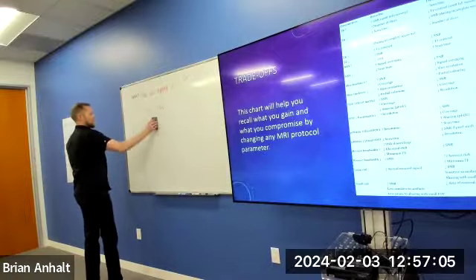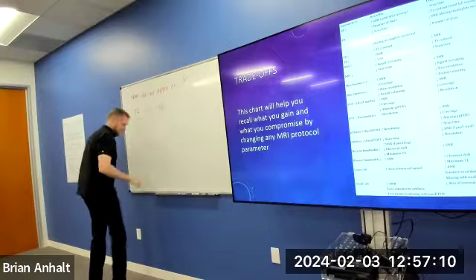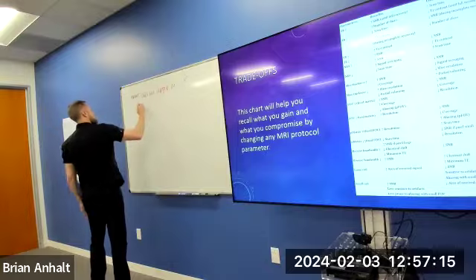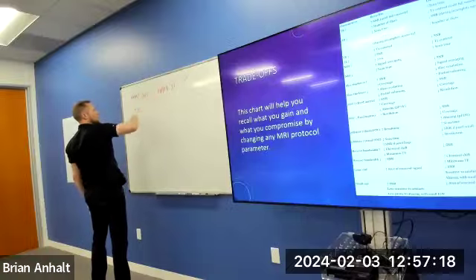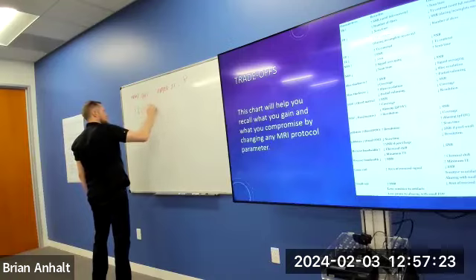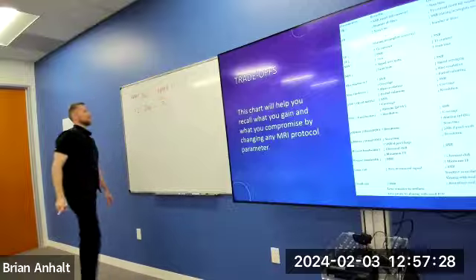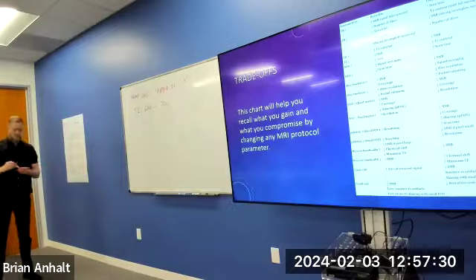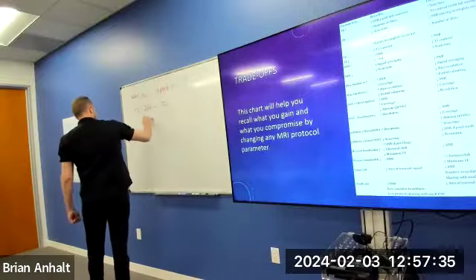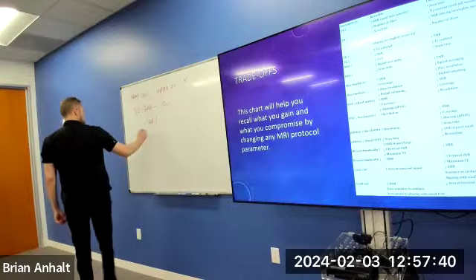What does not happen if TR changes? I want to say what does happen. Is the whole list. What happens if we take our 3000 TR and move it down to 700? SNR does what? SNR goes down. What else happens? Scan time goes down.